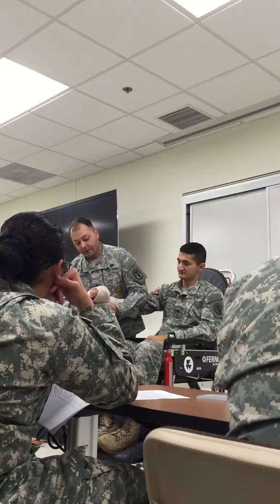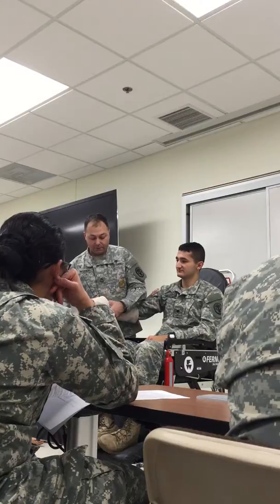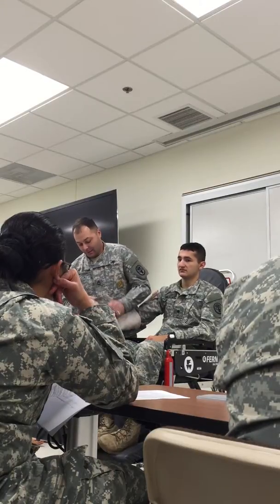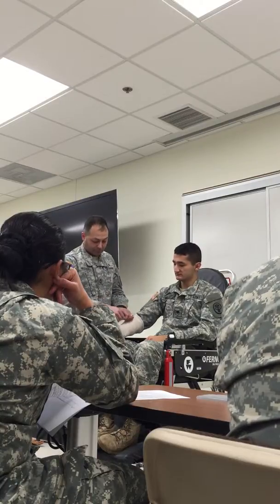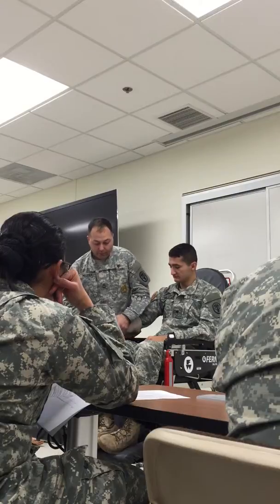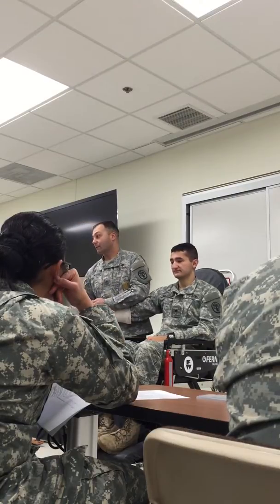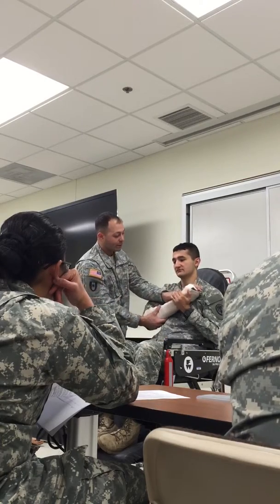I'm going to cover the hand but not the fingers. Why don't you want to cover the fingers? So you can assess for capillary refill. Capillary refill, right? Now I can check capillary refill, and I still have my window to assess the pulse. The patient has a pulse. Here you go, buddy. Hold that.